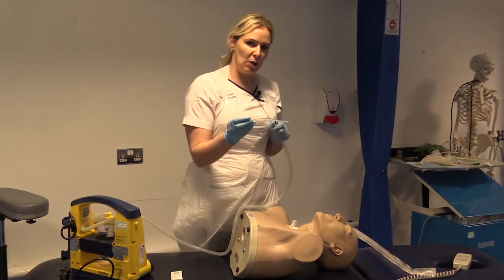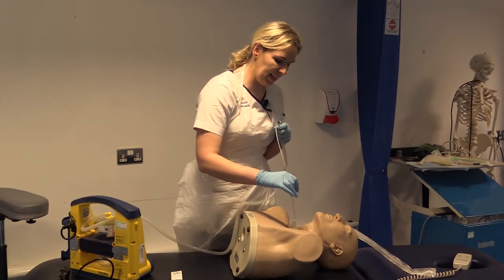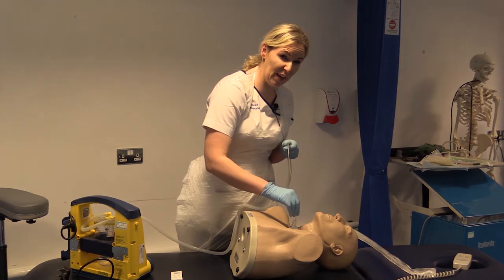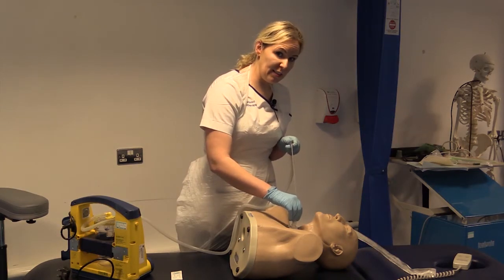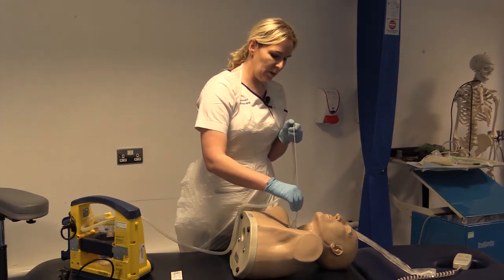Again, you're going to explain to your patient that suction is going to occur. You gently insert your catheter into the trachea, and again, you're going down nice and slowly, and you're looking for that cough or to where resistance is felt. If you feel resistance, come off about 1 centimetre, apply your suction, and slowly remove your catheter.